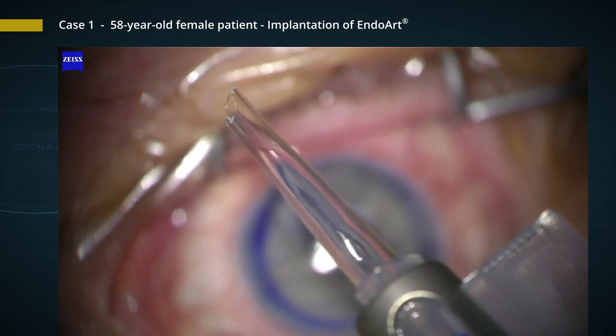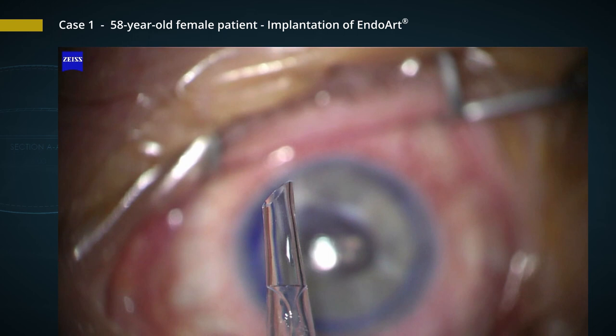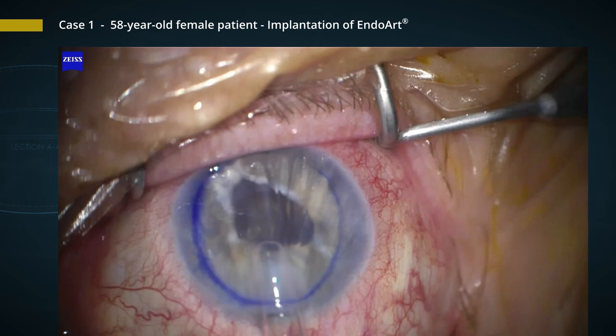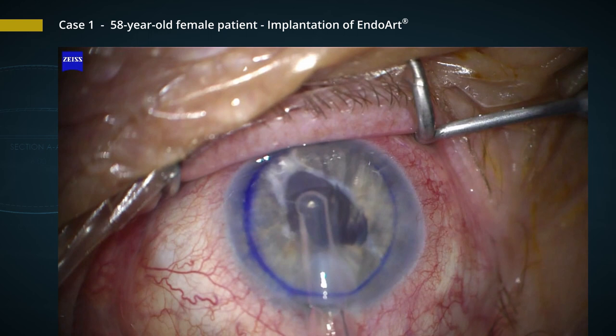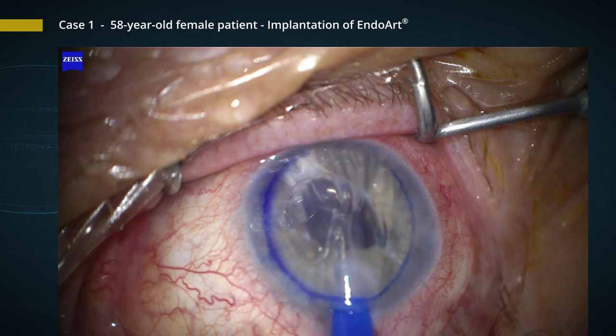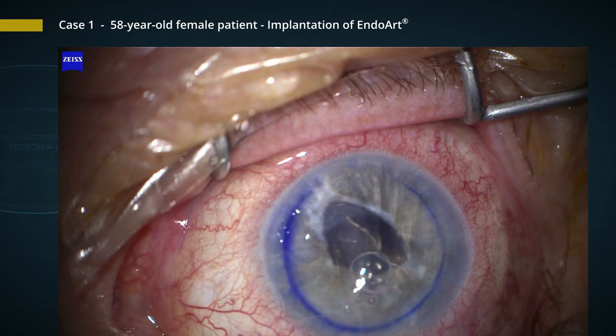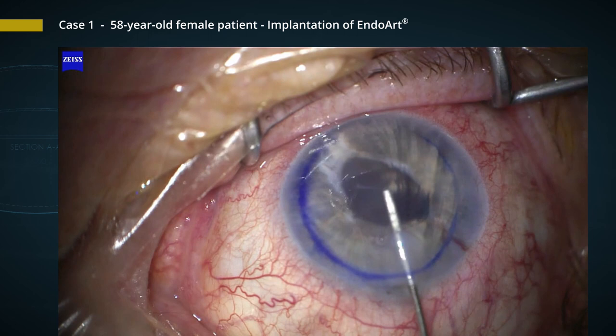For the implantation of the artificial DMAC lamella, we use a conventional intraocular lens injector. You can see here how the lamella is moved forward in the cartridge. We use a 2.5 mm incision to implant the device into the anterior chamber. First, you can see an air bubble coming out — that's not the implant — but then the implant follows and it lays down on the iris. In contrast to a natural human donor lamella, you can touch the artificial lamella. We take a Sutter cannula to lift it up against the cornea, and then do a first positioning with a small air bubble.